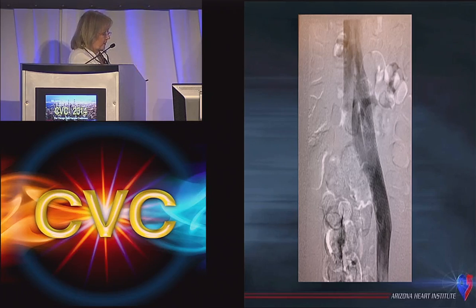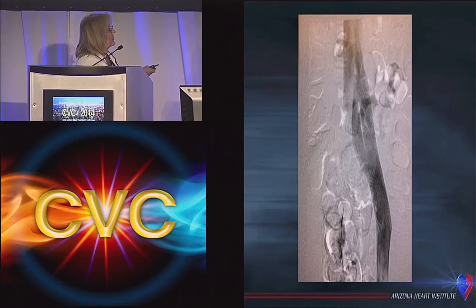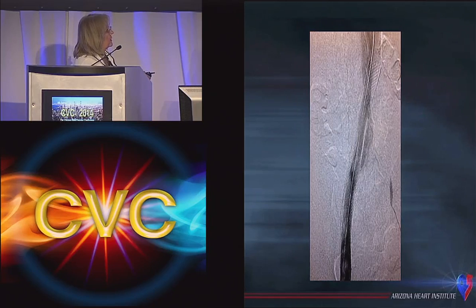I've seen this several times now, and I think that for the most part you can stent one channel. The other channel will stay as is. I always stent the external channel here, but it's important to stent all the way up into the cava. And in this patient, we stented a little bit too low, and I thought it was good.